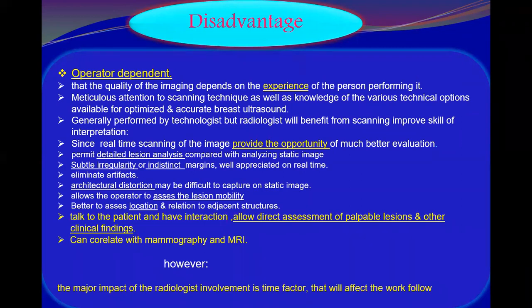Also, it will allow the operator to assess lesion mobility and to make sure you are scanning the clinical, targeting the clinical concern or the patient's concerning lesions.